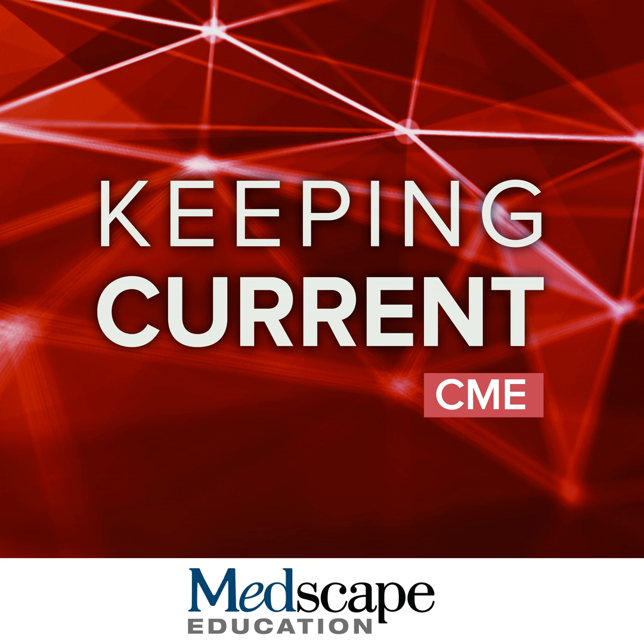So we're aiming for 50 millisecond temporal resolution, which is the frame time. We always use parallel imaging, and we try to aim to be able to acquire 1 to 2 slices per breath hold for complete cardiac coverage. So if you just consider with a cine acquisition, it may take 10 to 15 minutes to cover the entire heart with standard cine imaging approaches.